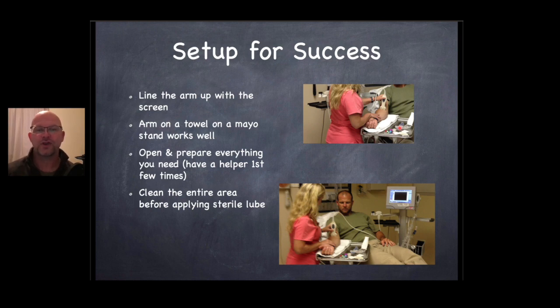I always assume I'm going to get one look at this, because just because you find it and you're like, okay, this is where I'm going to go, you put everything down, you clean the whole site, you put the jelly on, all those types of things, doesn't mean you're going to find that same view as easily. So what I do is I clean that whole area. I put a protective cover over the ultrasound so it doesn't get contaminated between patients. It's not on this older system here, but I'll have it use a protective cover.